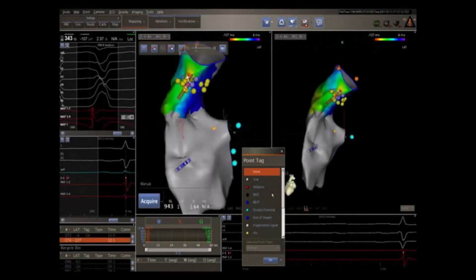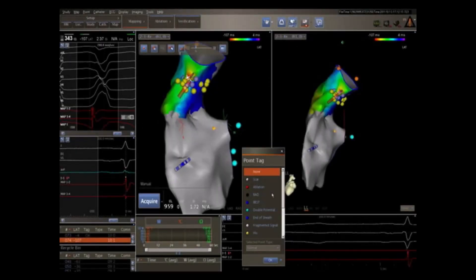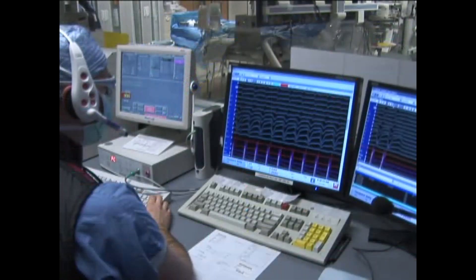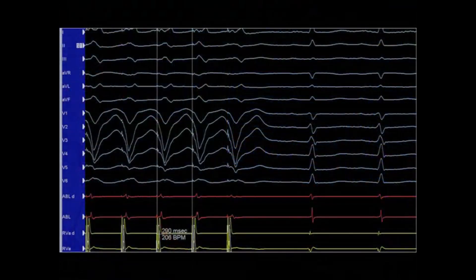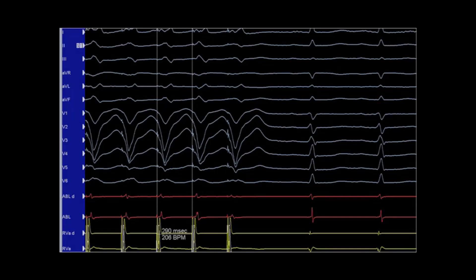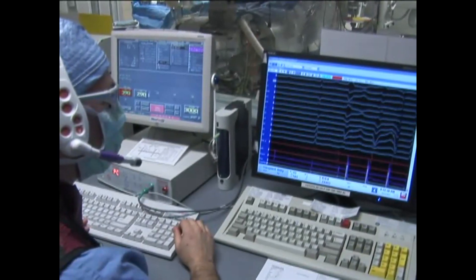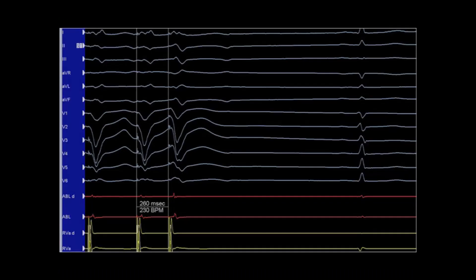Activation mapping using the 3D mapping system allows detection of the earliest electrogram within the outflow tract. If spontaneous ventricular tachycardia or PVCs are not present, ventricular burst pacing is performed. Programmed extra stimulation may also be completed but is less likely to induce the arrhythmia.